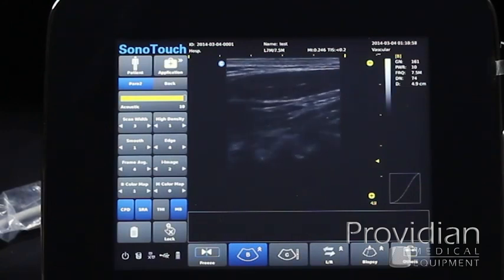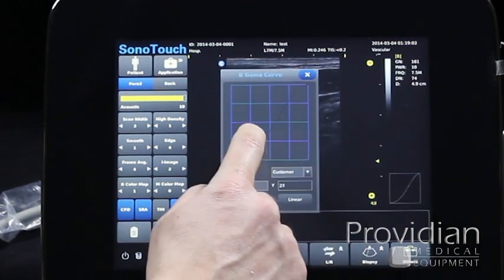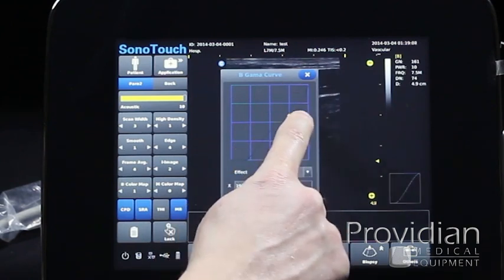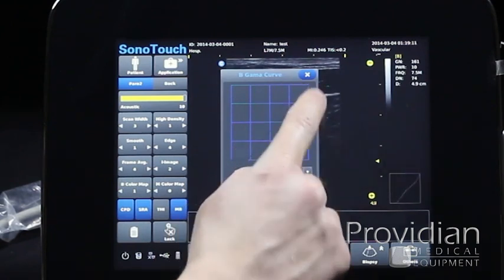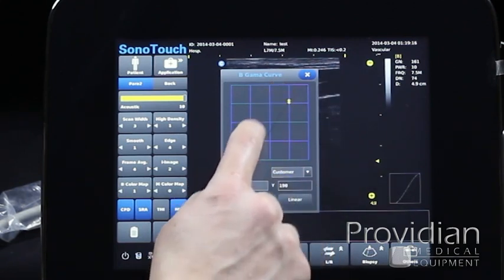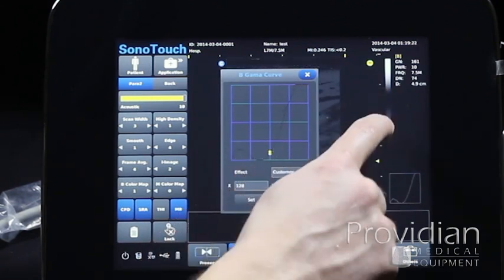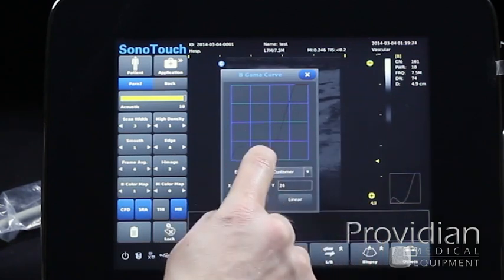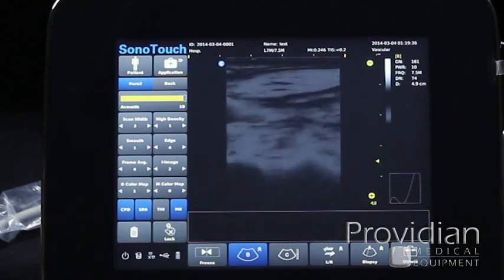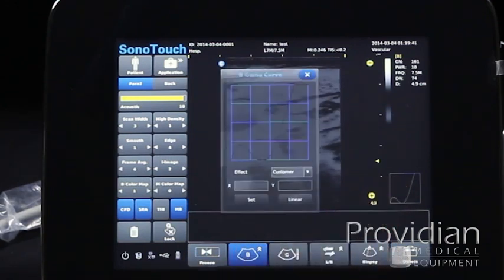Now, along with dynamic range, you often need to change your grayscale, and that's over here. You'll click on this and you can click and drag, increase your darks or lights, various. This is your gamma curve here, and you can save the preset. This is going to increase the brights of your whites or lower your darks. You can see here how your grayscale changes. We have some darks as bright. This is not something most people mess with, because you can see it can really mess up your image. But as you change the dynamic range, you'll often want to change your grayscale.